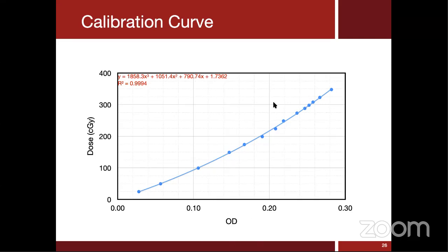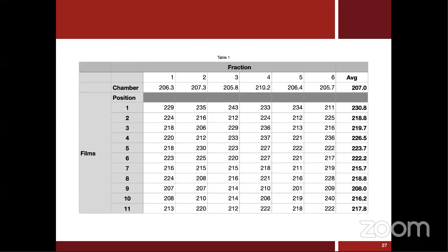And we just do a very simple polynomial fitting, this equation. For TBI, most of the doses are just going to be here. So even if we have a problem in the fitting in this region, it's fine. But it's important that within the 2 gray region, we have a good fit. And we place those films. I'm going to show you after the presentation how we do this. I will open the camera and show you.